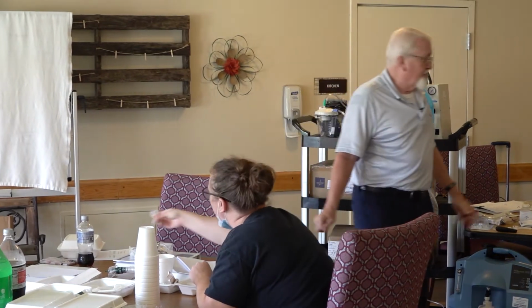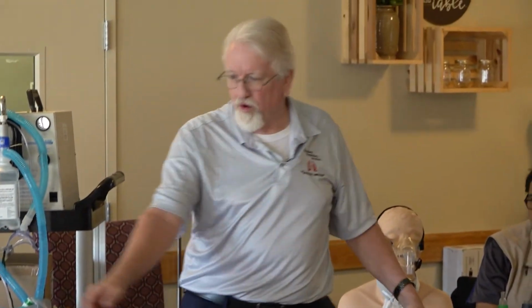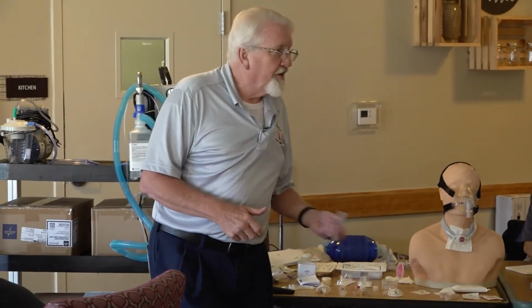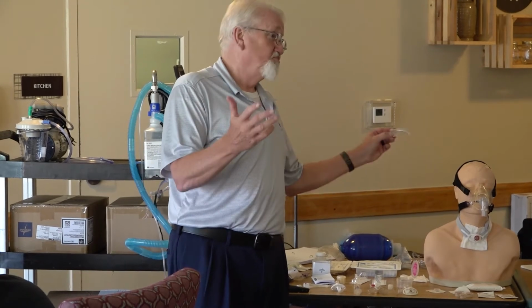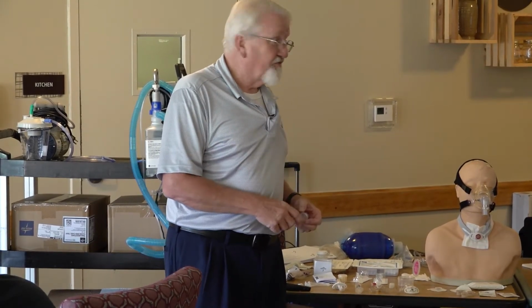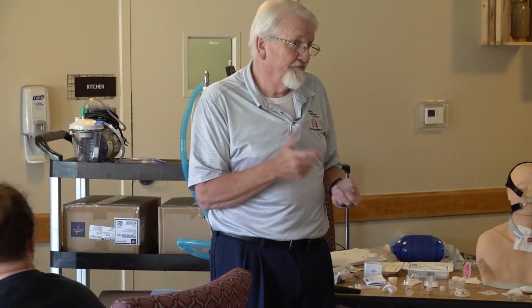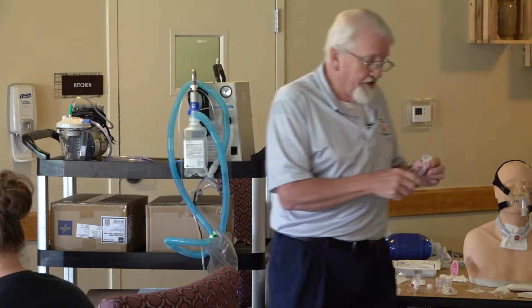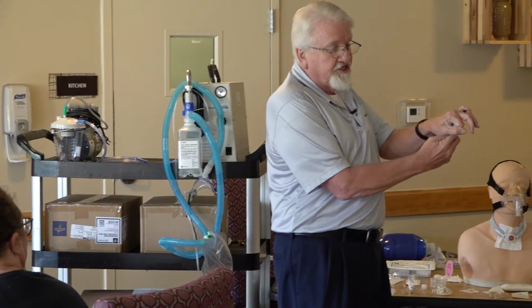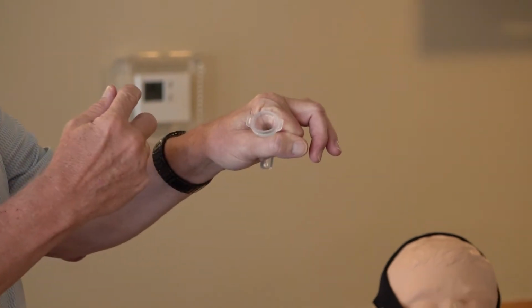So say you walk into Bob's room and you see his Lary tube laying on the floor. Just pick it up, rinse it under warm water, dry it off, put it right back in. No big deal. It doesn't matter if it was out 5 minutes or 5 hours. His stoma didn't change. Okay. So that's a Lary tube. Again, it just seats right there against the stoma, so no gauze or anything, and a regular trach collar.